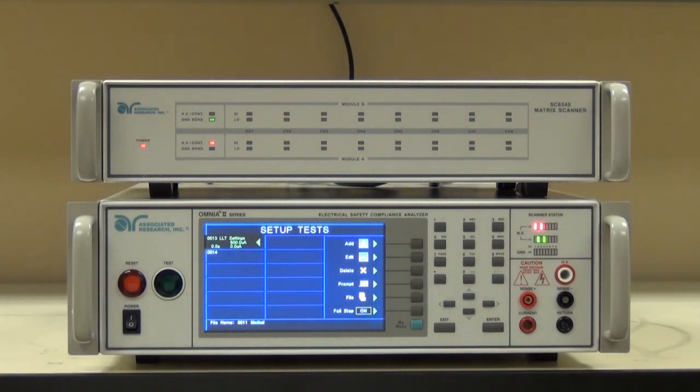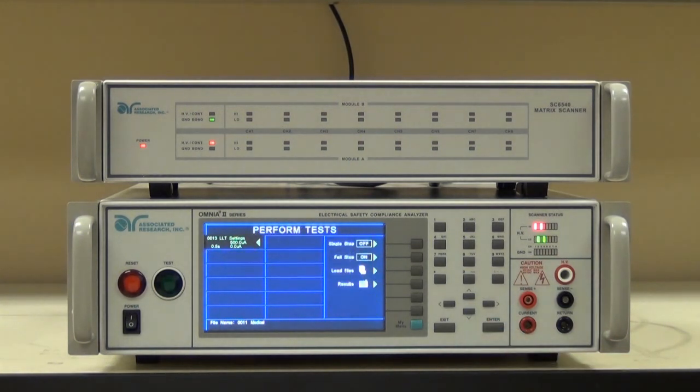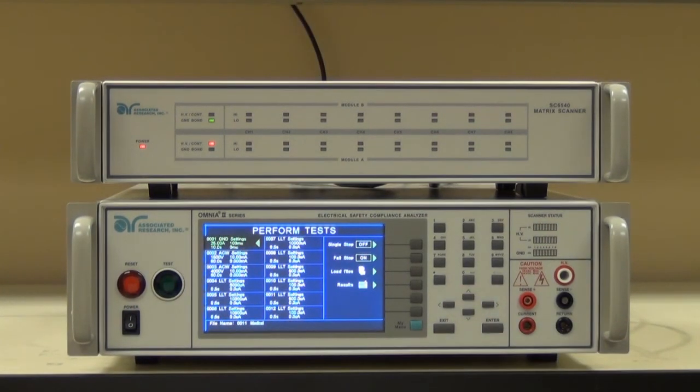This completes our test sequence. I'm going to hit enter twice to save the changes. This will take us to the perform test screen. Now we're going to run the test sequence and look at the results.